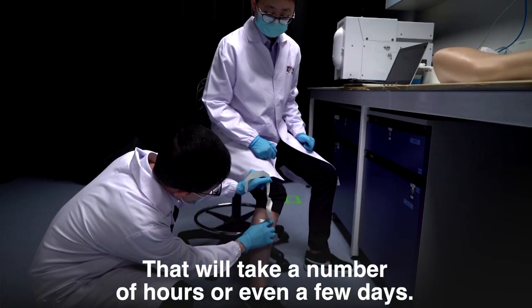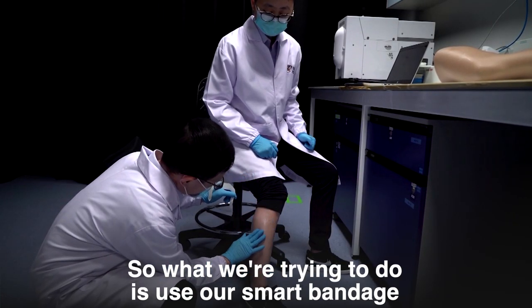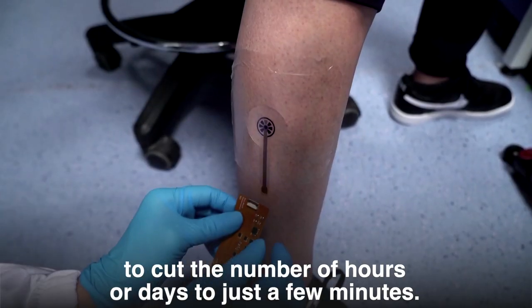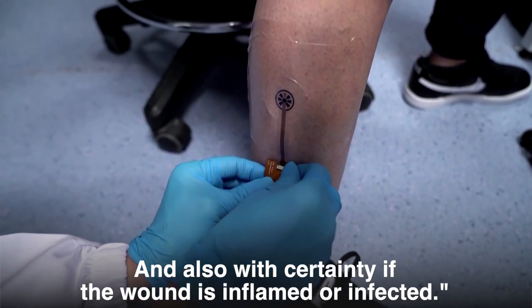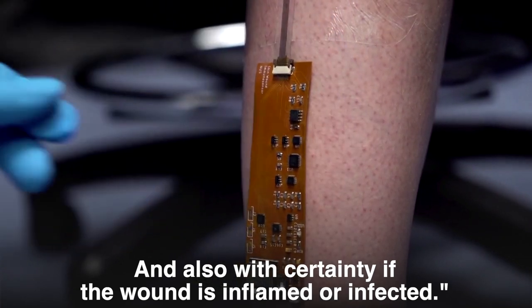What we're trying to do is use our smart bandage to cut those hours or days down to just a few minutes, and also determine with certainty whether the wound is inflamed or infected.